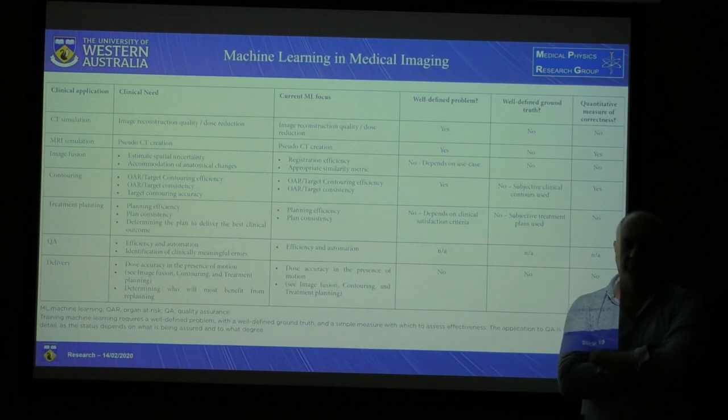So they applied the same VMAT plan to the actual CT, and then they applied that same plan to the synthetic CT, which was generated from the MRI, and they compared those two. They should be the same dose distribution essentially, but there are differences because it doesn't completely create the identical image. So they compared the two VMAT plans. They compared the two dose distribution maps.